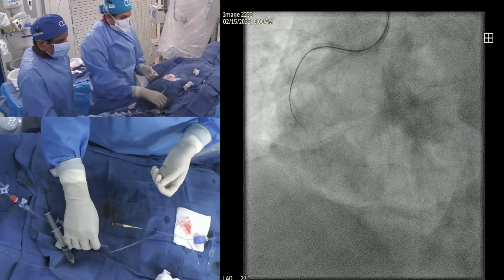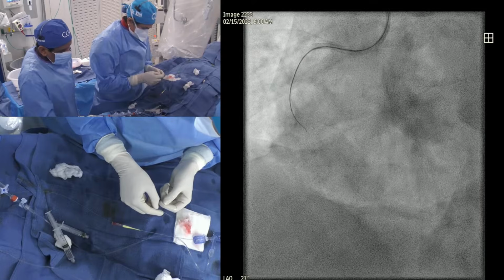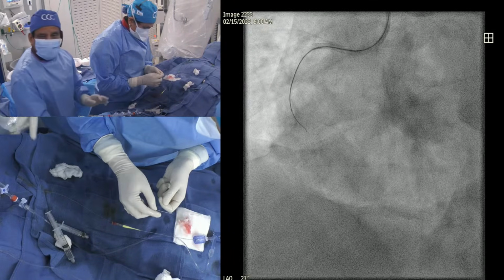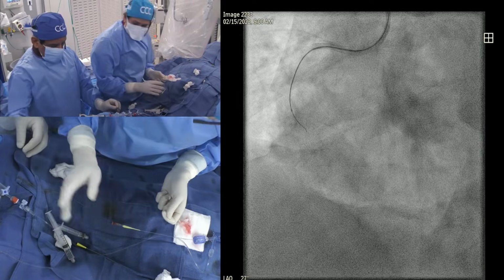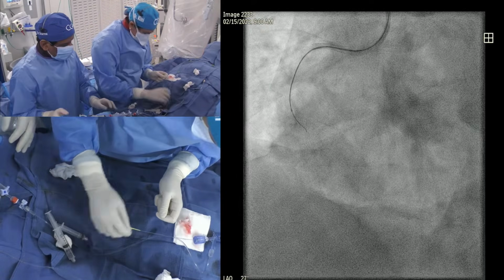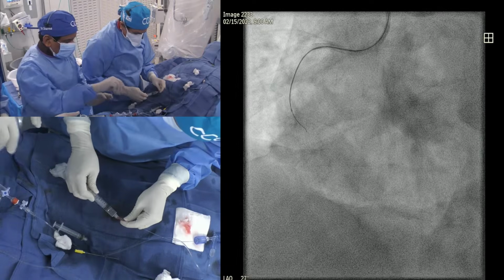Anu, when was the last CTO where you used the Hornet? It's not often, maybe 2 per month, right? Yeah. About 30. Usually with our 2-3 escalation, we have crossed. Right. Yeah, this is done. Okay. This is a Boston wire.